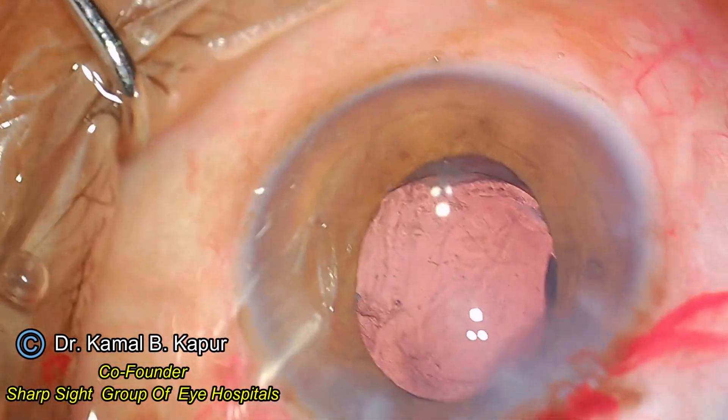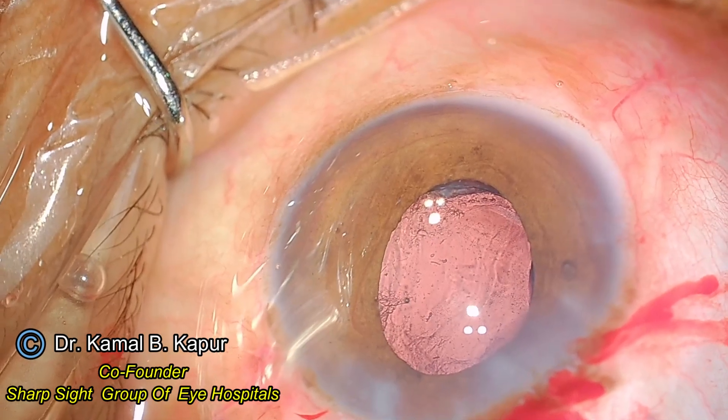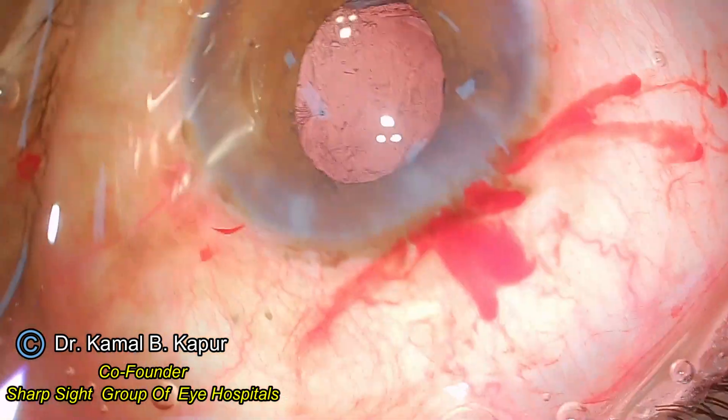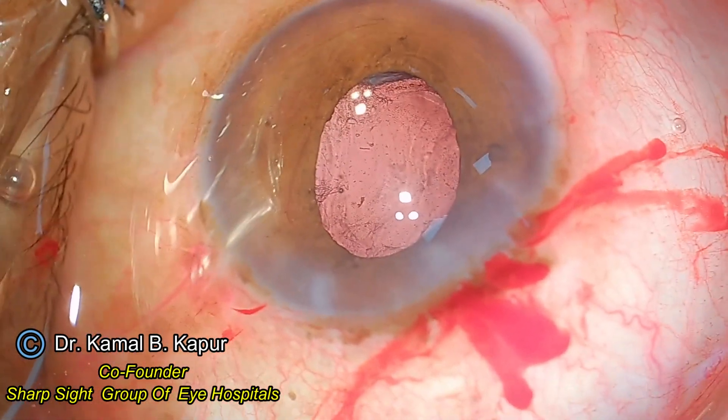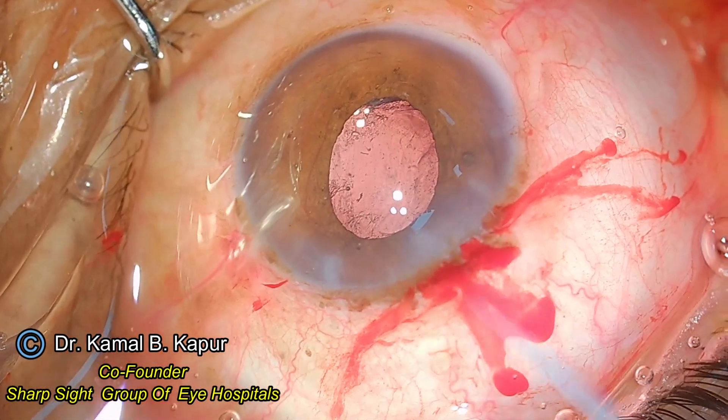The IOL is now in place. We will instill some miotic to constrict the pupil. If you like my surgical videos please share with your friends and colleagues. I am putting some miotic here and you can see the pupil slowly closing down — that signals the end of the surgery.